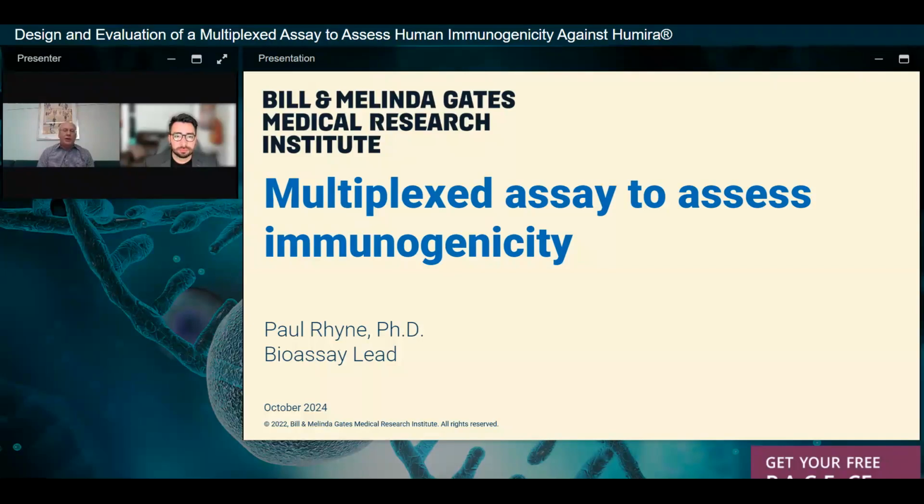And we chose the screening assay with the isotyping assay, mainly because for isotyping assays, there is no guidance in the regulatory guidance documents that really tells you how to go about doing one. And multiplexing is really set up nicely for that. So that's why we combined those two.